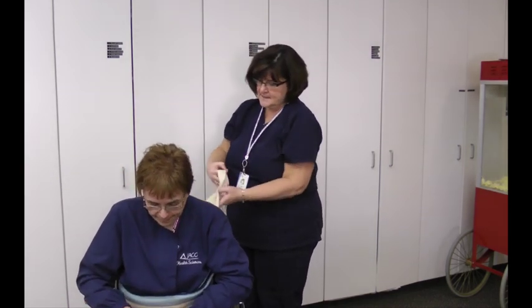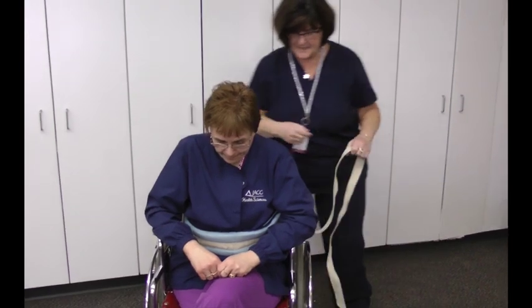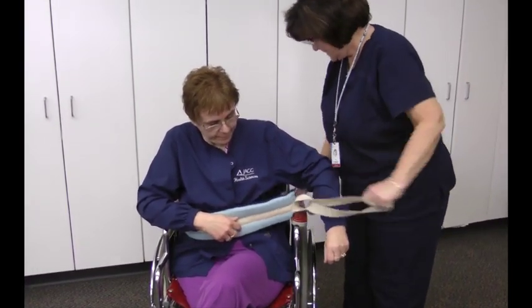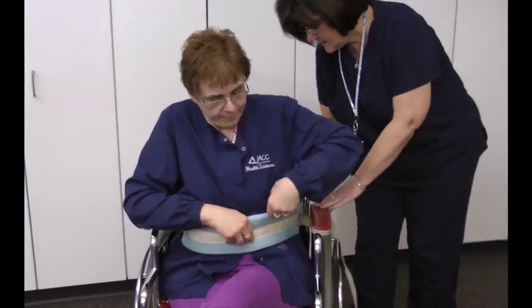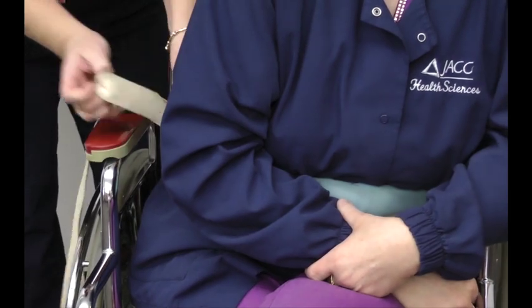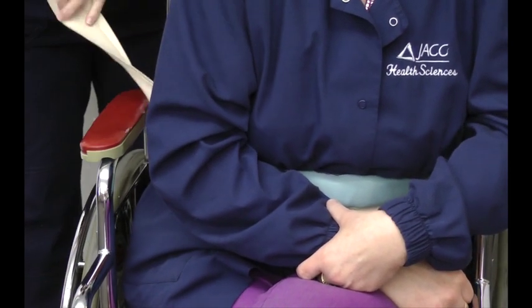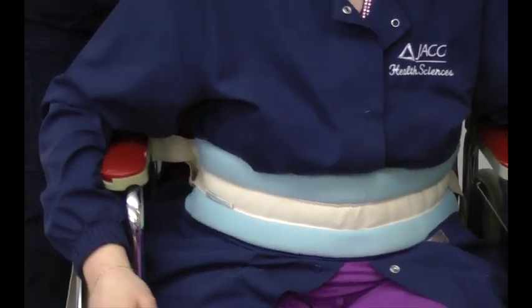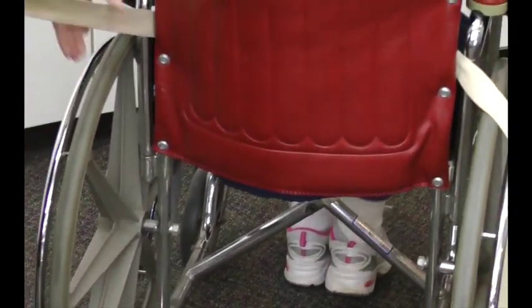I'm just crossing it in the back, and I'm bringing it around to the side. I have to put it through the loop here. Get it comfortable. And then Melissa, I'm gonna turn your wheelchair around so I can demonstrate how it comes right through the back here.